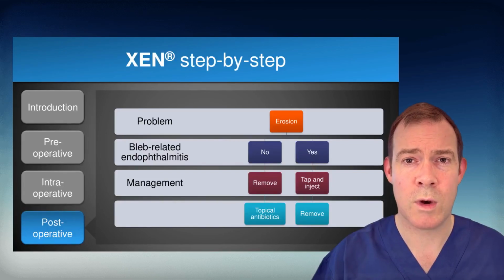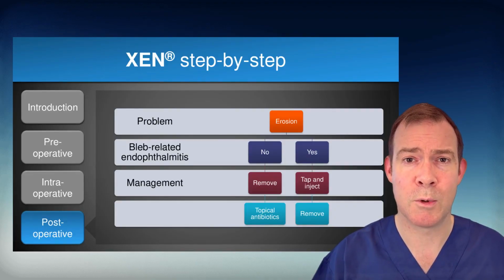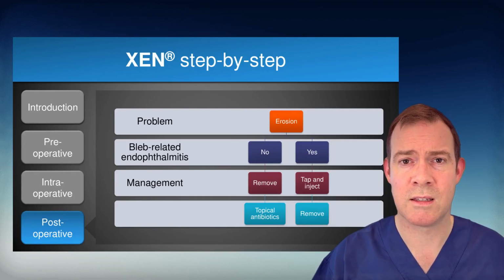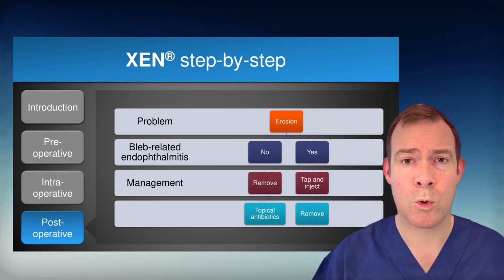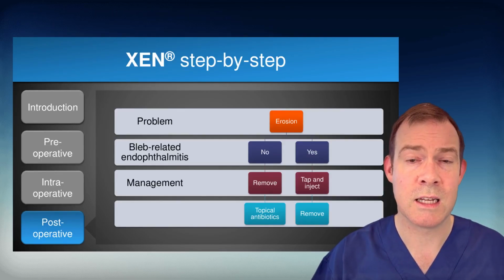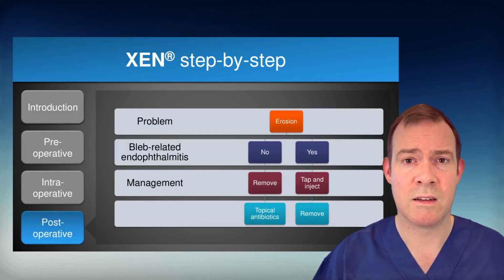XEN erosion is a rare but potentially serious complication after surgery. If the XEN becomes eroded but there's no infective complications, it should be removed quickly. Topical betadine can be instilled in the eye, and often the XEN can be removed easily with forceps at the slit lamp before prescribing topical antibiotics. If there are already bleb-related infective complications, then these need to be managed as such, often with tap and inject, and removal of the XEN is recommended.